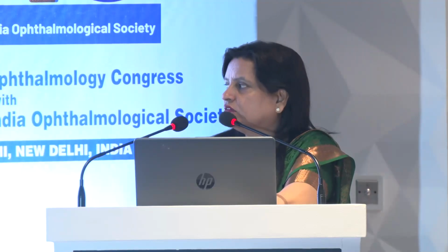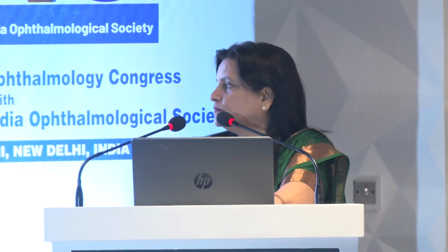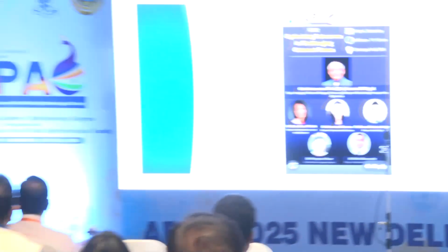So I think I missed that in my videos because I moved them fast. So the important thing is that you should put OVD, something like Viscoat or HPMC, on the corneal surface. So as soon as you put that, the visibility will become a lot clearer, and also for that split of a second it will get magnified. So it will allow you to actually do the steps. Suppose you can't see the rexis, you put a blob of viscoelastic, it will get magnified, and then visibility will also improve.